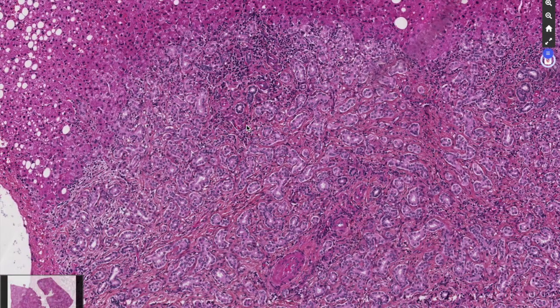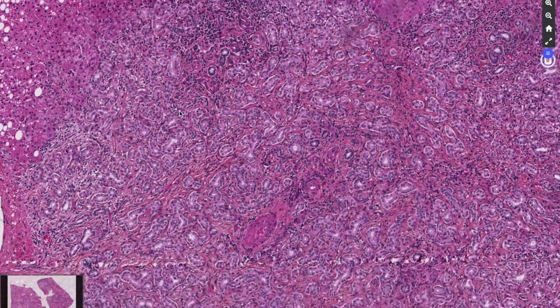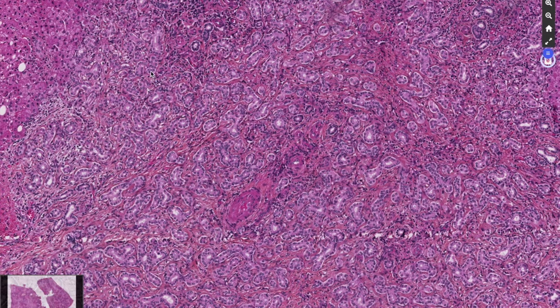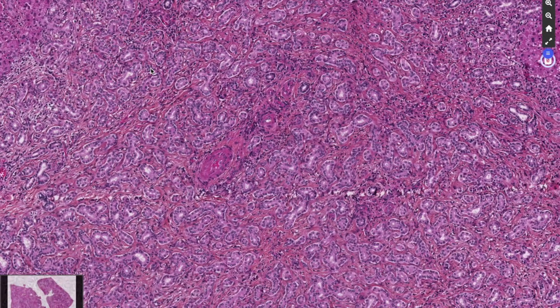proliferation, a true neoplasm, because in half of these cases you will find a BRAF V600E mutation, and you can also identify these mutations if you have the anti-BRAF V600E antibody, and you will see a positive cytoplasmic staining. So it may help a little bit for the diagnosis. And of note is that bile duct hamartoma, von Meyenburg complexes, do not have this mutation.